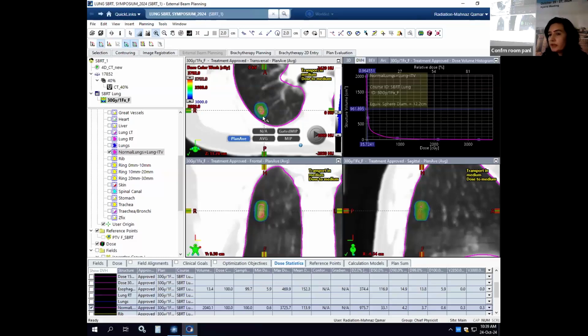So in this case, the way we judged it, one of the phases was even moving 6 millimeters. And since we wanted to at least increase the treatment percentage within the useful beam, we used that. So we determine the phases based on the motion of the tumor, and our criteria is anything more than 5 millimeter, we will gate. We will not treat in those phases.